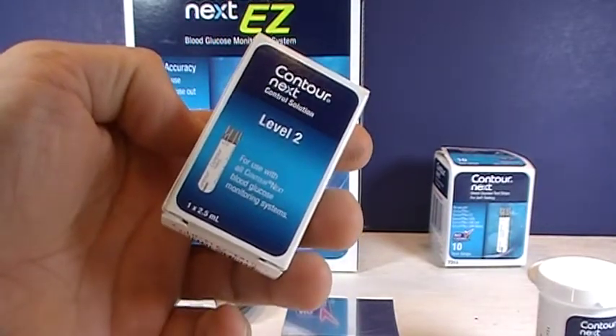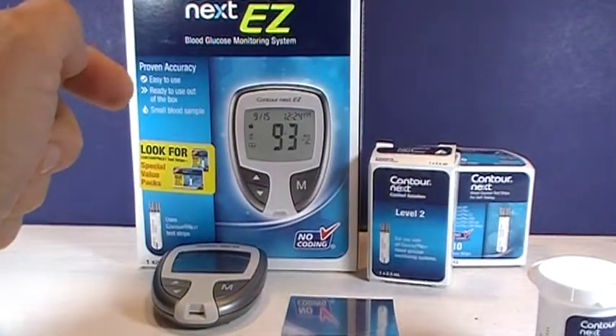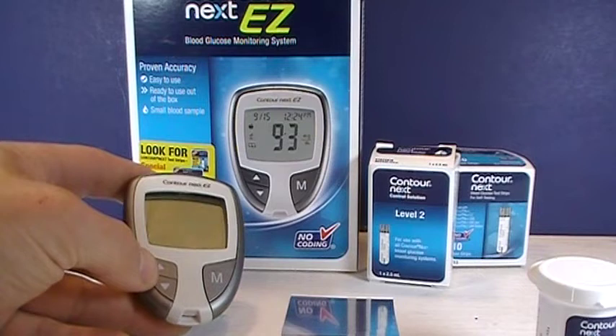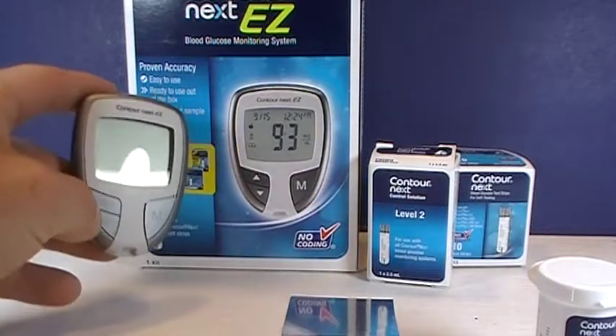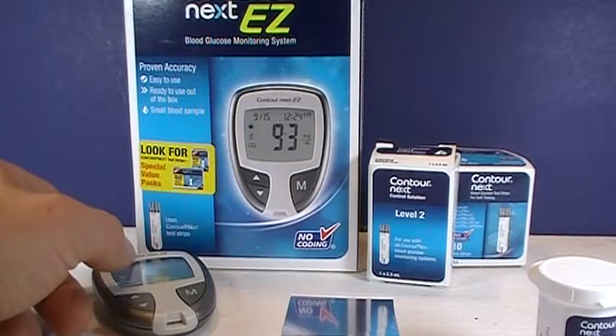I happen to have a bottle of control solution level 2, so I'll show you how that control solution works. The control solution is used if you feel like you're having problems with the meters or strips. Officially, the manufacturer recommends using it for the first time, whenever you open a new bottle or package of test strips, if you think the meter is not working properly, or if you have unexpected blood sugar results.